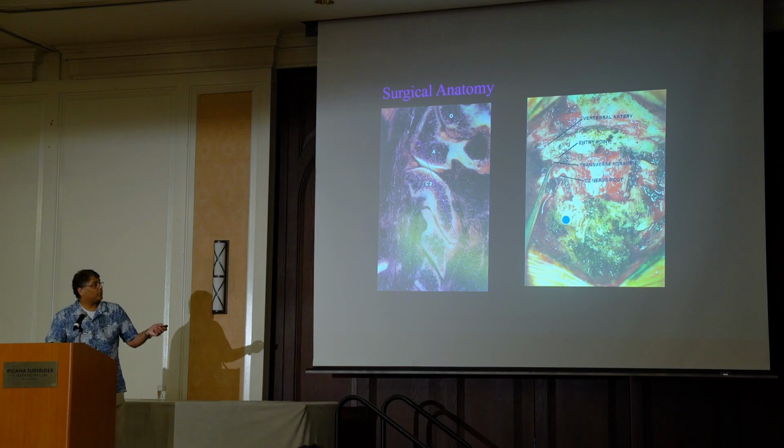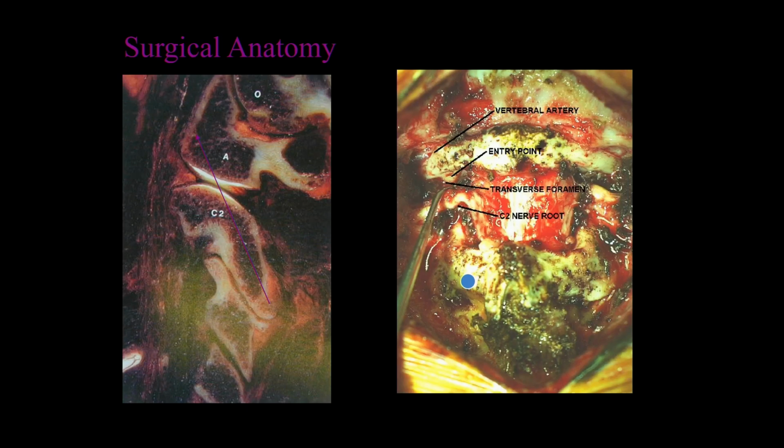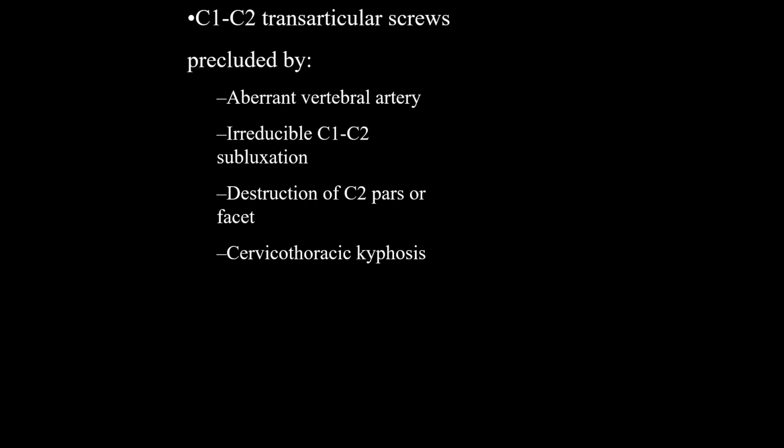Intraoperatively, you also have to figure out, are you going to see it? Where is it going to be? It's going to be way out here, and it's going to be deep. So what happens is there's a big venous plexus here, and people bipolar this thing. I don't recommend using a bovie anywhere near here, but if you bipolar this thing, you keep following that venous plexus out laterally, you will ultimately end up near the vertebral artery. So it's just, you got to be careful when you get out there.